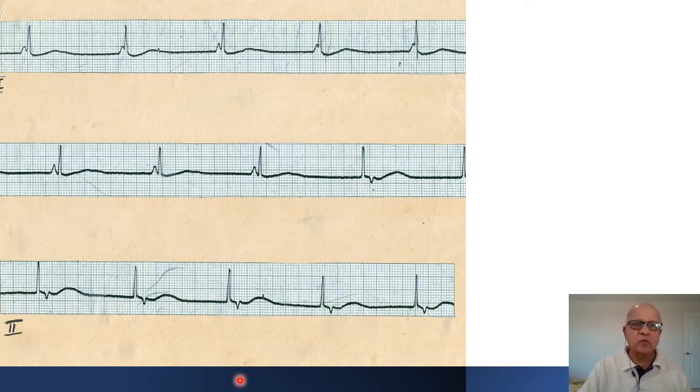Now, my question was, what investigation will you do for this patient? You can order a simple 24 or 48-hour Holter monitoring, isn't it? A continuous Holter monitoring for 24 to 48 hours. If the patient gets any symptom of dizziness or syncope at that time, he has to make a note of it and you diagnose what is the arrhythmia which occurred at that time. They may be getting long pauses, sinus pauses or asystoles.